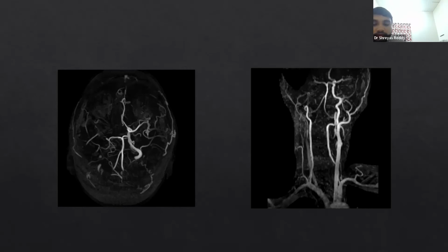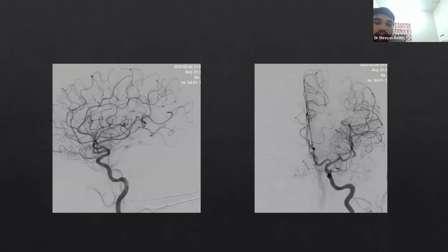In this patient also, you're not seeing the ICA, and the patient has acute stroke and has come in with an NIHSS, so you intervene as an interventional radiologist. We'll just wrap it up for curiosity's sake. What have we done here? The stroke is on the right side, and we have performed a left-sided cerebral angiogram. Why? We would want to look for collateral status. Exactly. So before going and intervening on the affected side, we confirm the collateral status.